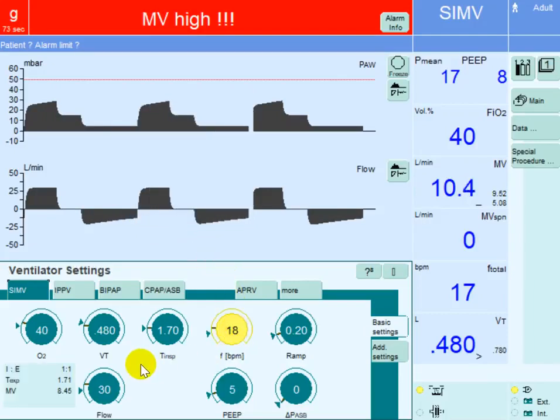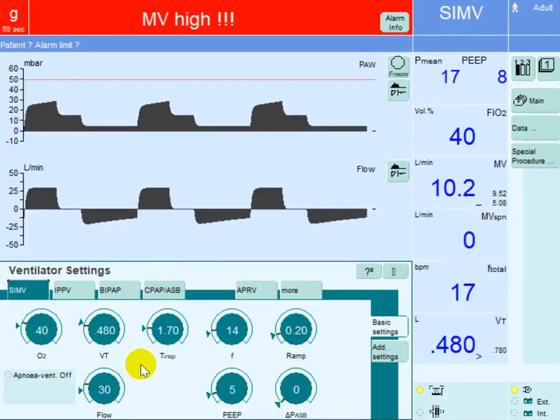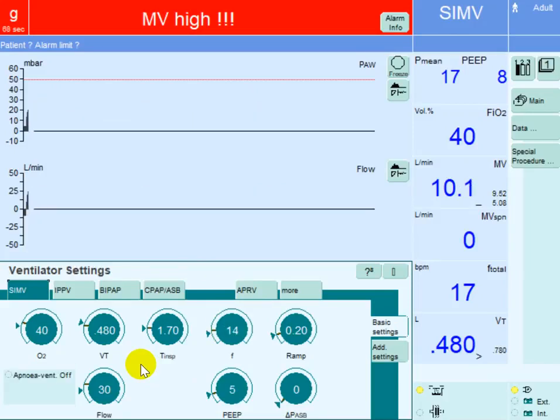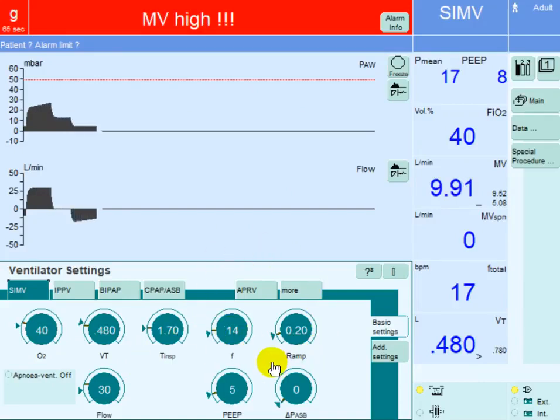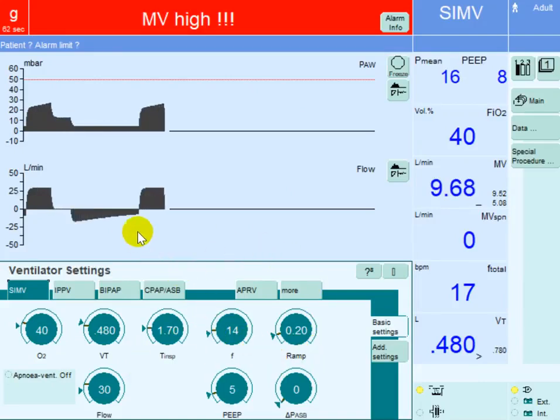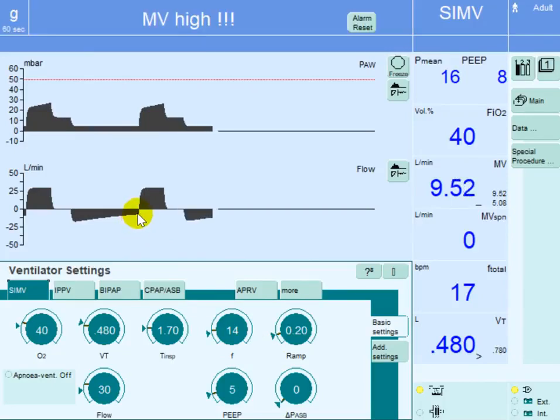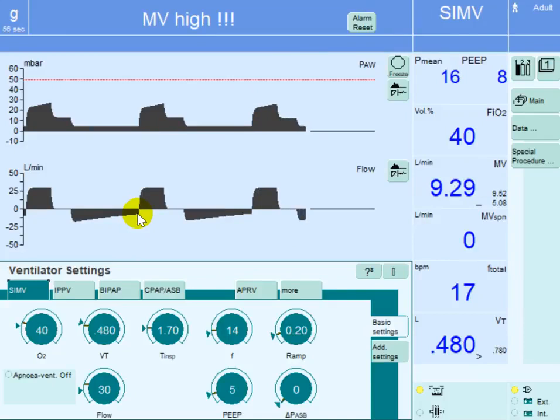The second thing we can do is reduce the respiratory rate, which is slightly elevated. We can go down to 14 breaths per minute. By decreasing the respiratory rate, we are changing the I:E ratio — we're gaining more time in expiration. And you can see how the dynamic hyperinflation syndrome is improving.